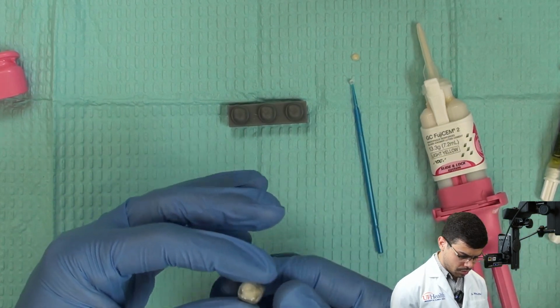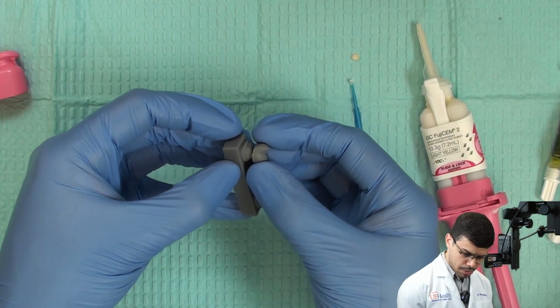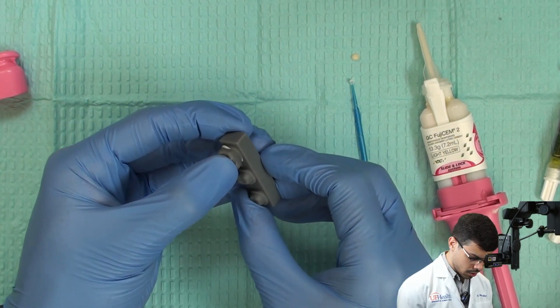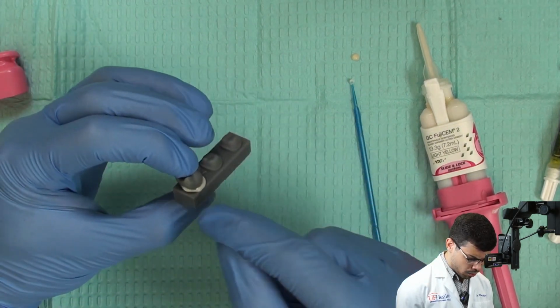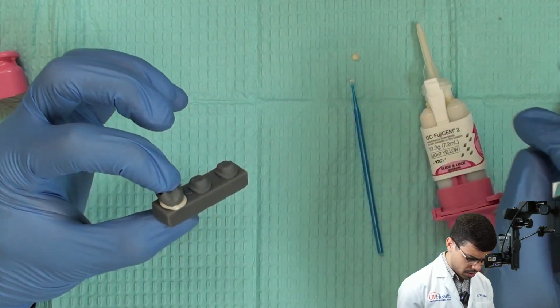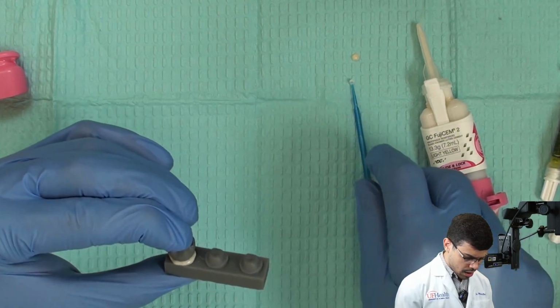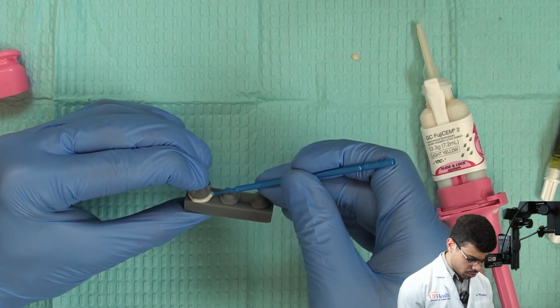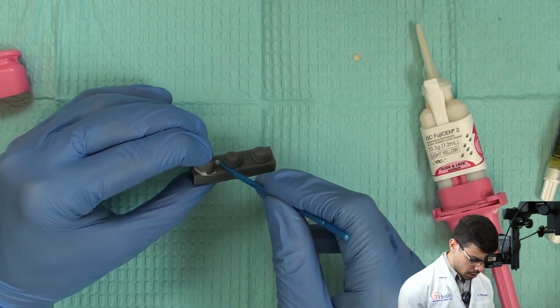So now that I'm ready, I already know the position that I have because I have try-in. I'm going to go ahead, press, and hold, okay? Make sure that you have cement all over, that it's forming this ring of it. So once you have this, you can get the micro brush and start removing the excess, okay? So now I'm going to start removing the excess of cement. Here we are.